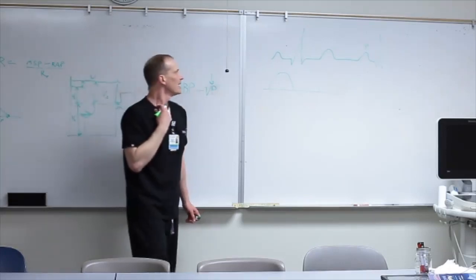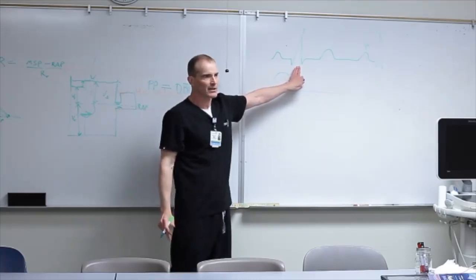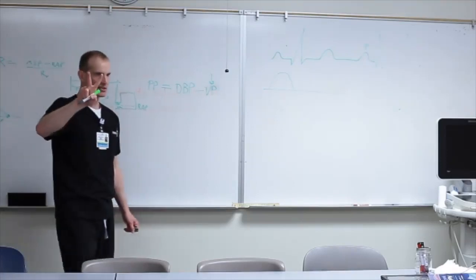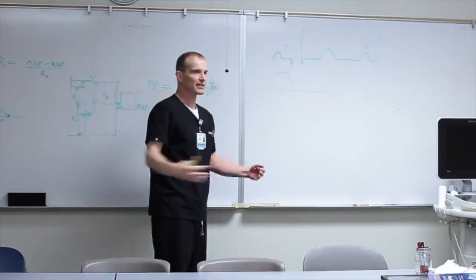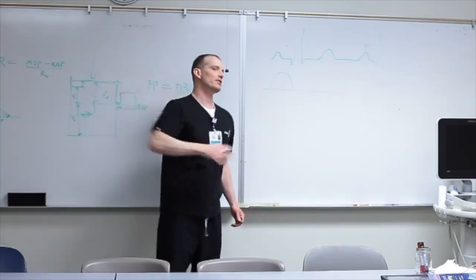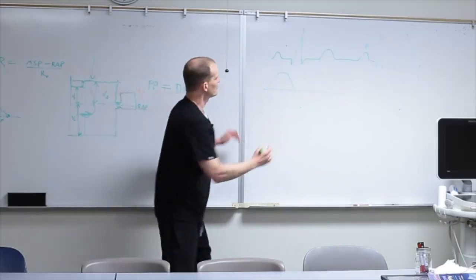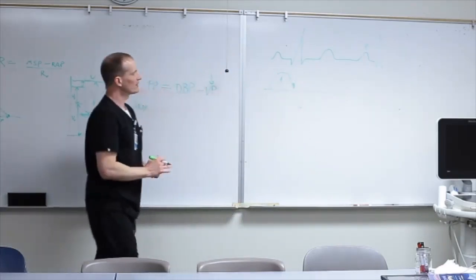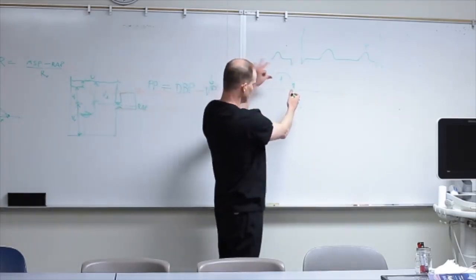okay? And then we enter systole, okay? So two things happen hemodynamically as far as the venous return during systole. The first thing is that the right atria relaxes, and so it sucks blood in, right? So we get a decrease in pressure of the JVD as blood's going into the heart. And so we get a little bump here, and the valve closes, there's a little C wave here. This is called the main wave, okay?